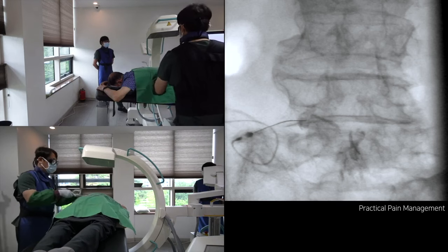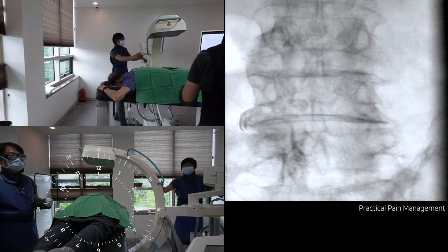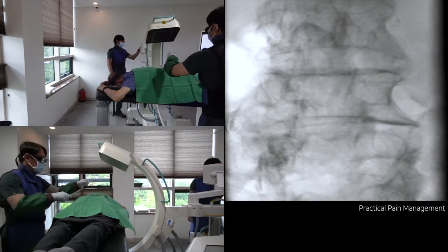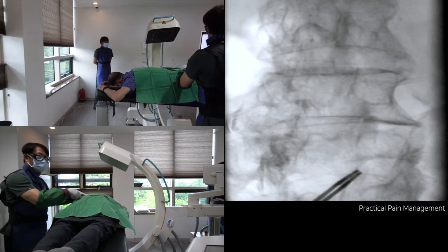I will clean the surgical site because I spent time multiplying the germs. Let me go to the right L4-5 facet joint. It also shows a blurred inferior joint line. So, please give me a right ipsilateral oblique image, about 30 degrees of rotation. Now I can see a joint line. Again, just lower than the joint line is the target.